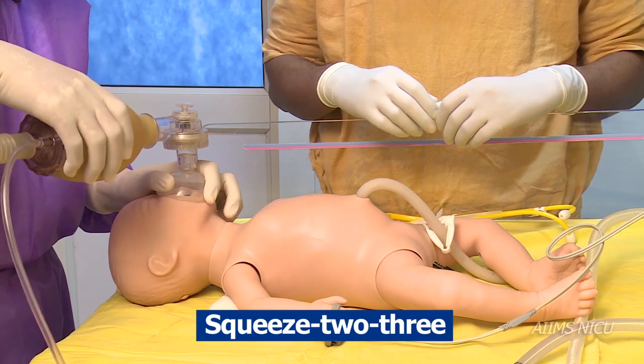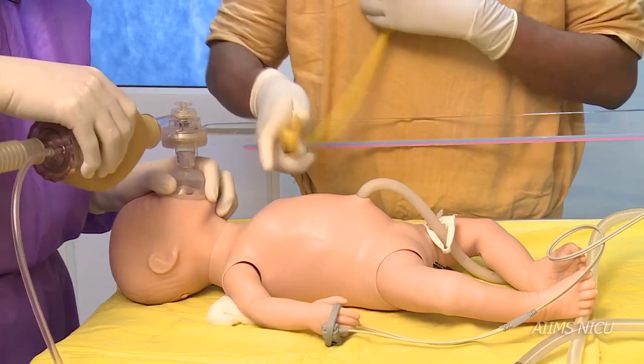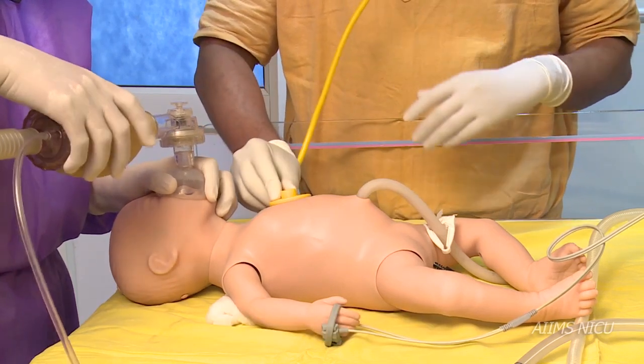Continue bag and mask ventilation for 30 seconds, then assess for an increase in heart rate and look for chest rise.